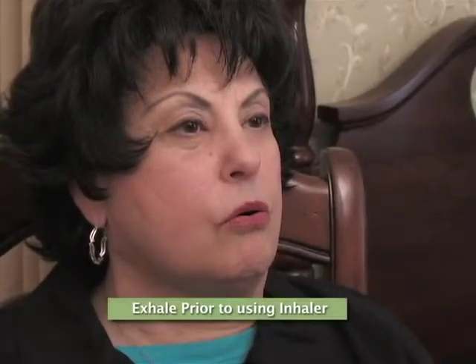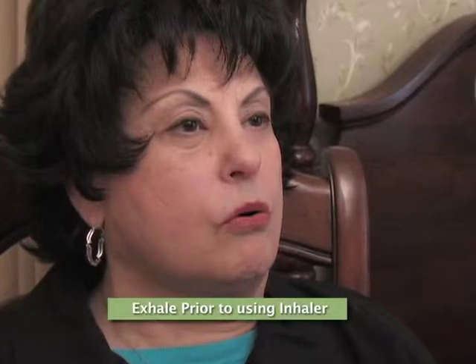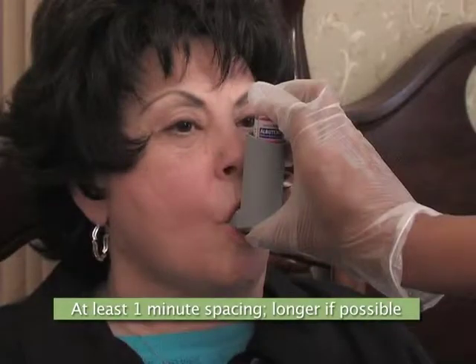Instruct the resident to exhale prior to using the inhaler. This creates more room in the lungs for the inhaled medication. If using more than one inhaled medication, wait at least 1 minute between medications, or longer if possible.